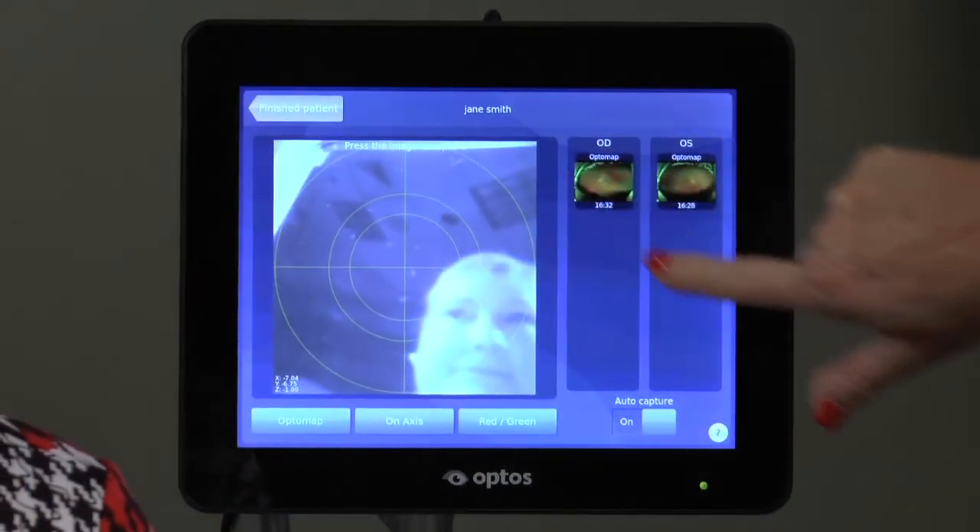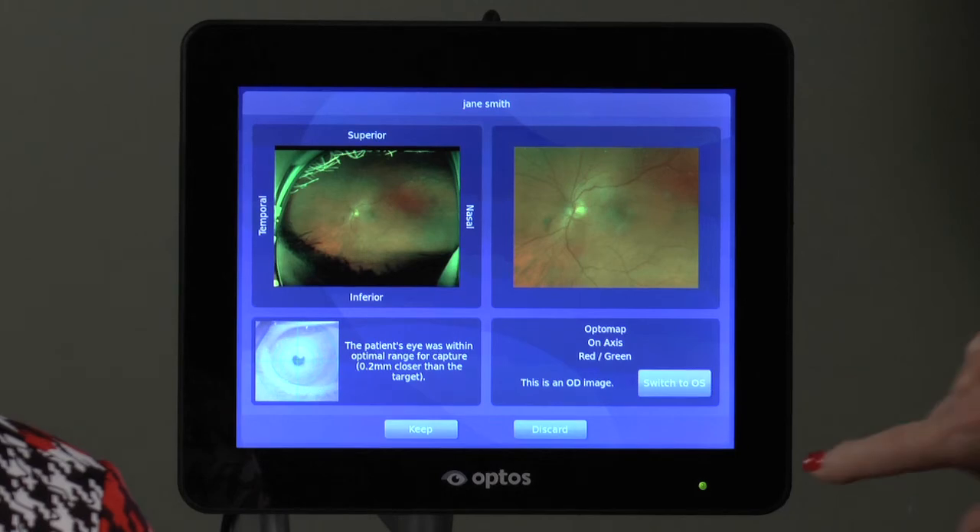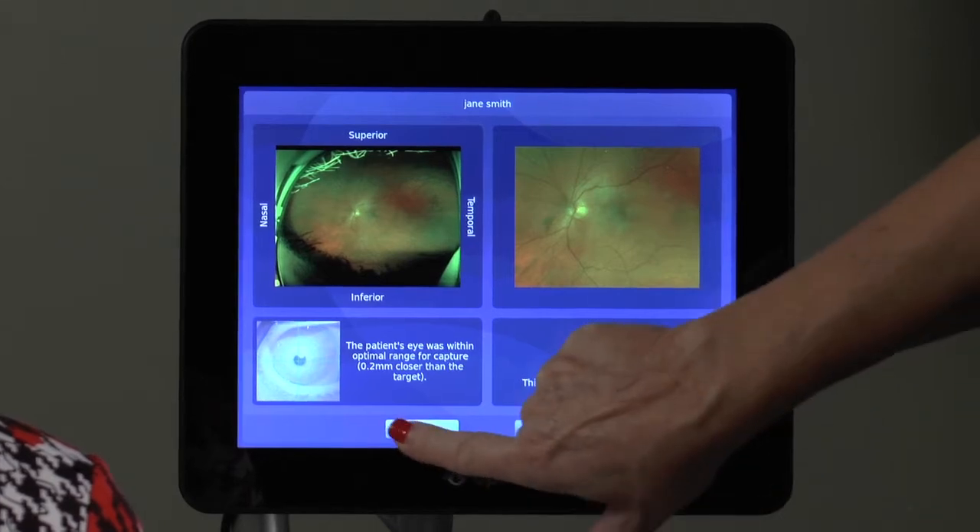If you wish to review an image, touch the thumbnail and it will bring you back to the capture screen, where you can switch laterality if necessary.